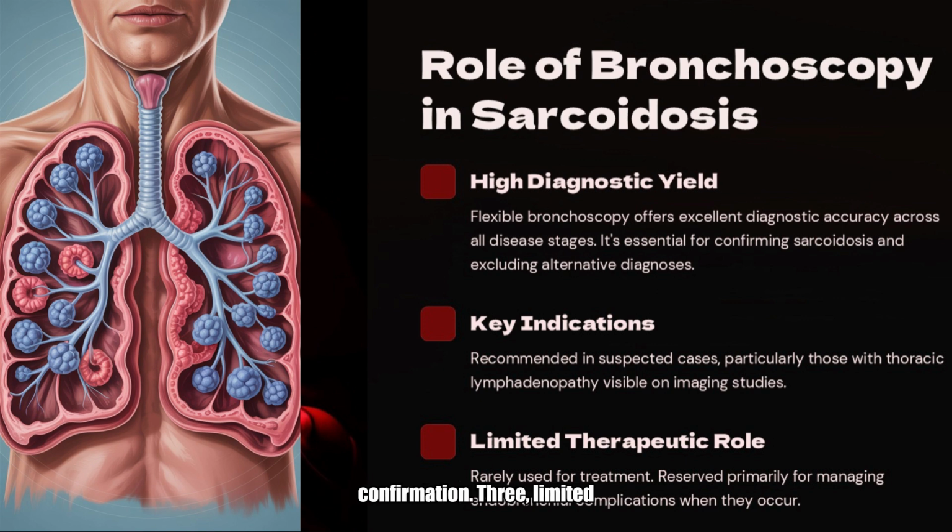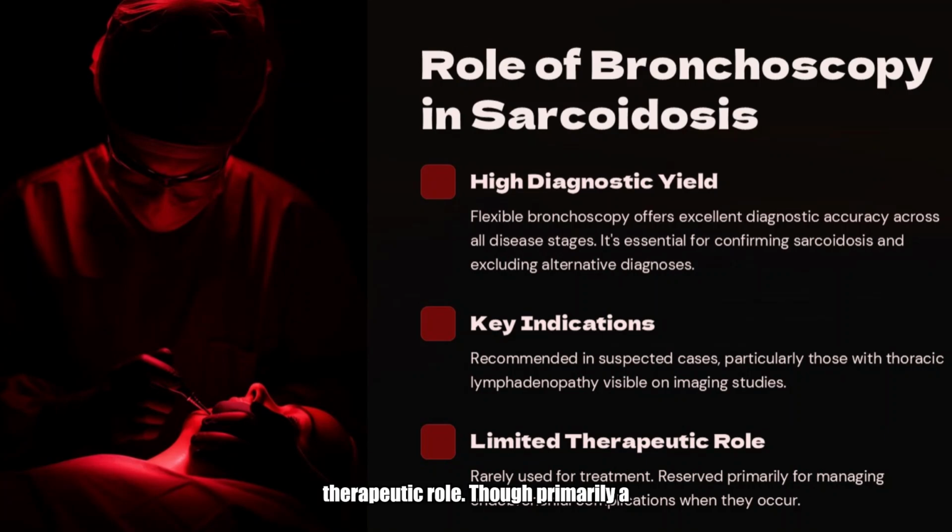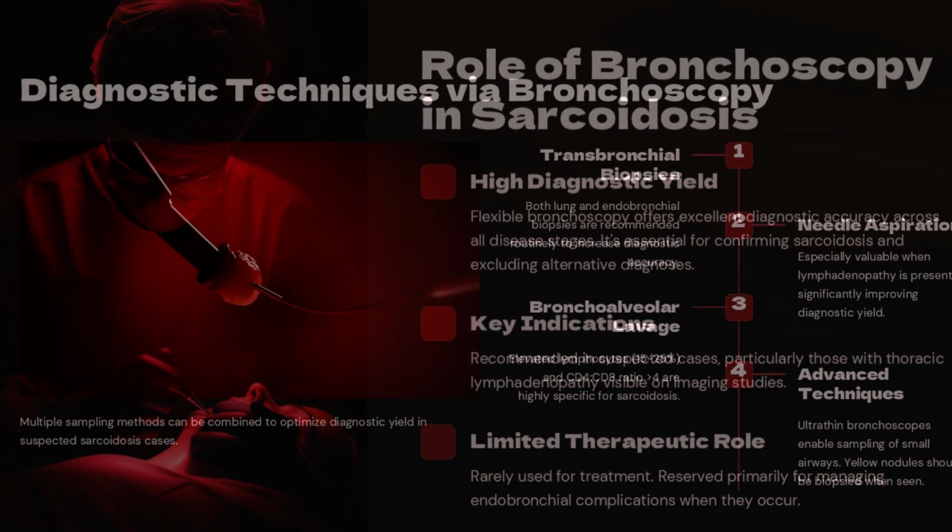3. Limited therapeutic role. Though primarily a diagnostic tool, bronchoscopy has a limited therapeutic role in sarcoidosis. It may be used to manage airway complications such as obstruction or bleeding, but does not directly treat the granulomatous inflammation. Its main value lies in guiding diagnosis and staging.